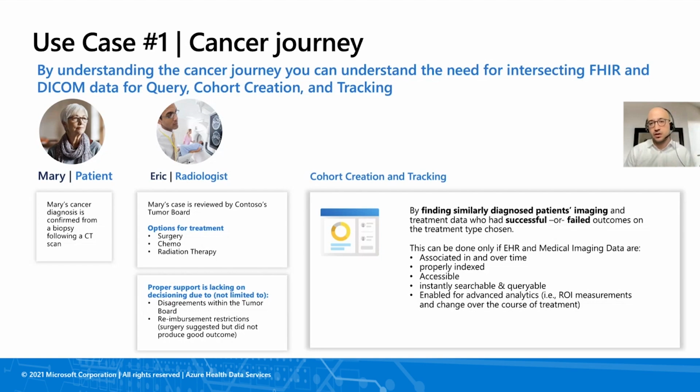And according to that, the physician who makes the decision on the treatment path also needs to provide that data analysis as part of his or her decision for that patient. So the key activity that will help the tumor board find similar diagnosed patients' imaging, whether it is a failed study or a successful study, really goes through our DICOM service.